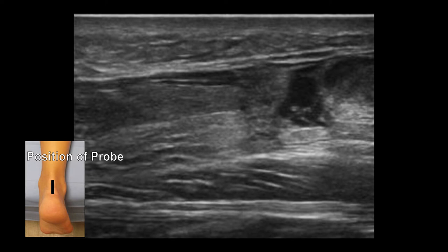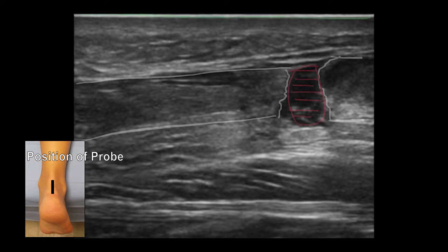We can see here a complete Achilles tendon rupture, which is seen in the long axis view. As indicated by the white, you can see the normal Achilles tendon with its echogenicity and fibrillar architecture. Separating the two ends is hypoechogenicity, which could be the space between the tendons, but may also be hemorrhage from the trauma that took place in order to cause this rupture.